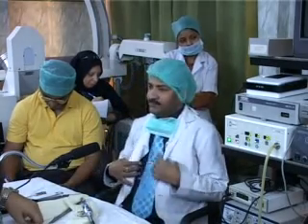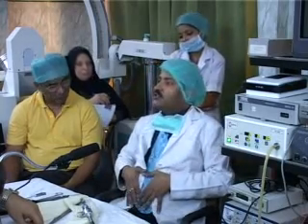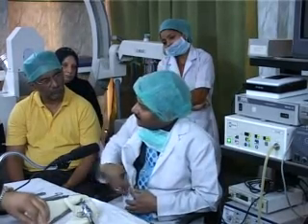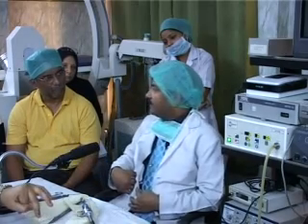What does it mean? If I have to create a pneumoperitoneum which should produce a preset pressure of 12, actual pressure of 12, then I need minimum 1.5 liter gas in my abdomen, and maximum is 6 liter.